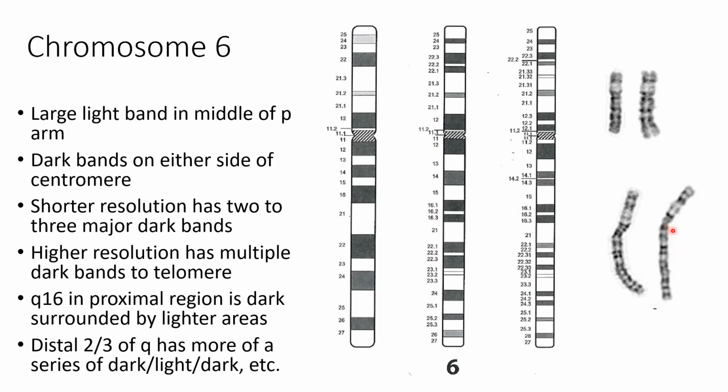Then you're going to get a series of areas. Right under the centromere, we've got, again, you could call it a shoulder pad, but a darkly stained area. Here's a dark band, this doublet here, which does not separate at the lower resolutions. And then this region you will find doesn't always band very well either, so it may kind of look like a smear on an electrophoresis gel sometimes. But on the Q arm, we definitely want to see these 3 distinct dark bands.